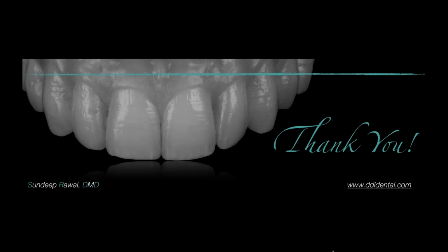So I'm a big advocate of always starting out with baby steps. If I had to pick, I would always start with an intraoral scanner because I can start with data acquisition at the most basic level, which is natural tooth dentistry. I can start with doing things like inlays, onlays, crown preps. Obviously you can do full arch natural tooth restorations, but you can do the very basics. You can do night guards. You can do orthodontic appliances, aligners. You can do all types of stuff and really integrate the intraoral scanner into your practice.